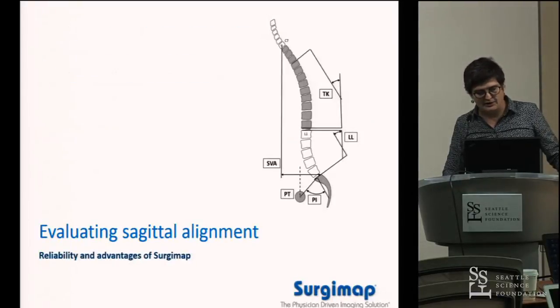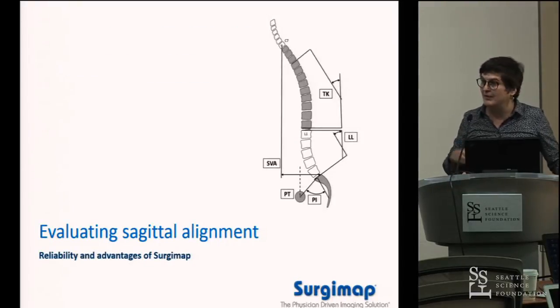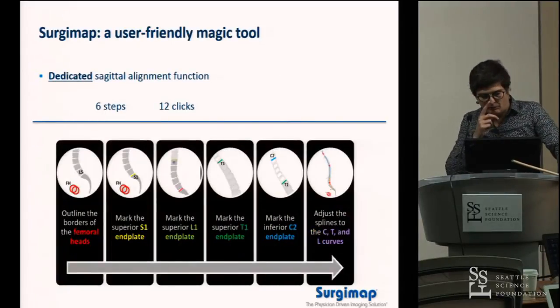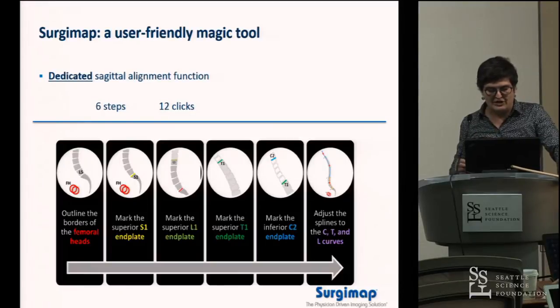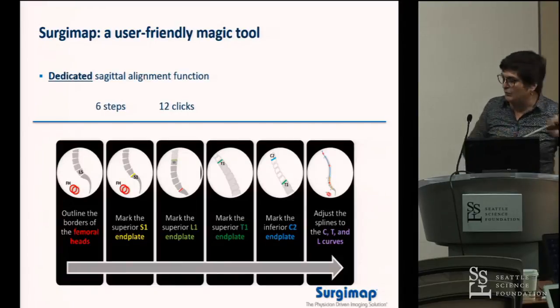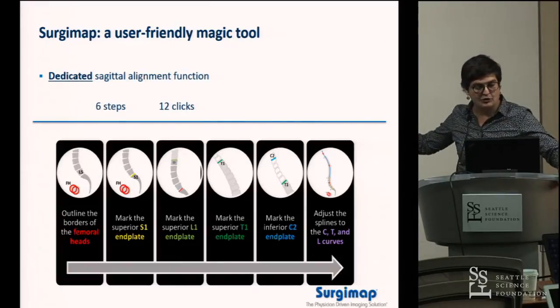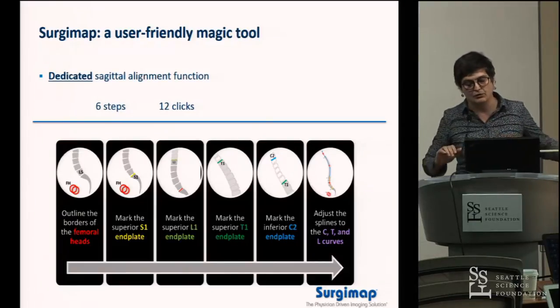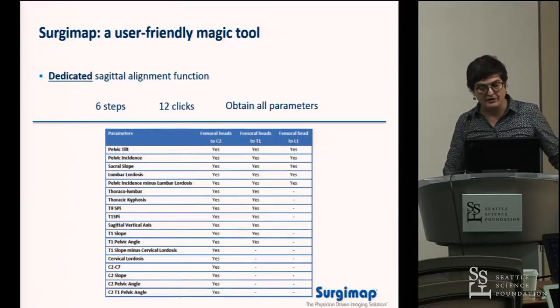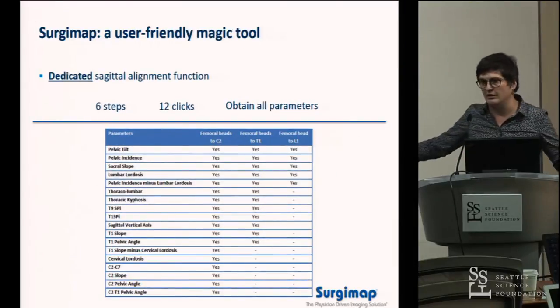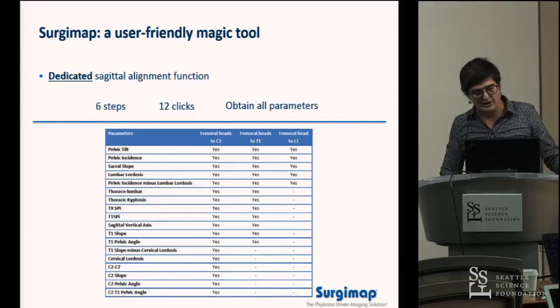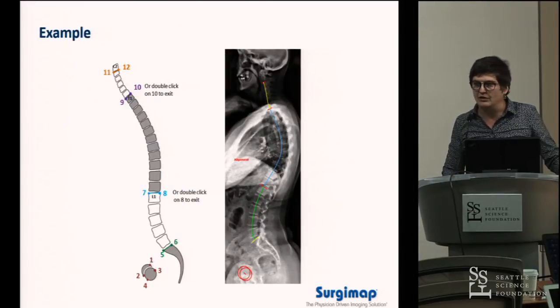Sagittal plane measurement can appear complex, sometimes even academic — but with SurgiMap you can follow an animation guide. You identify the femoral head, sacrum, L1, and T1. If you want to include the cervical spine, you also click on C2. Based on those few landmarks, all the parameters described in the literature — or at least the most common ones — are automatically displayed.